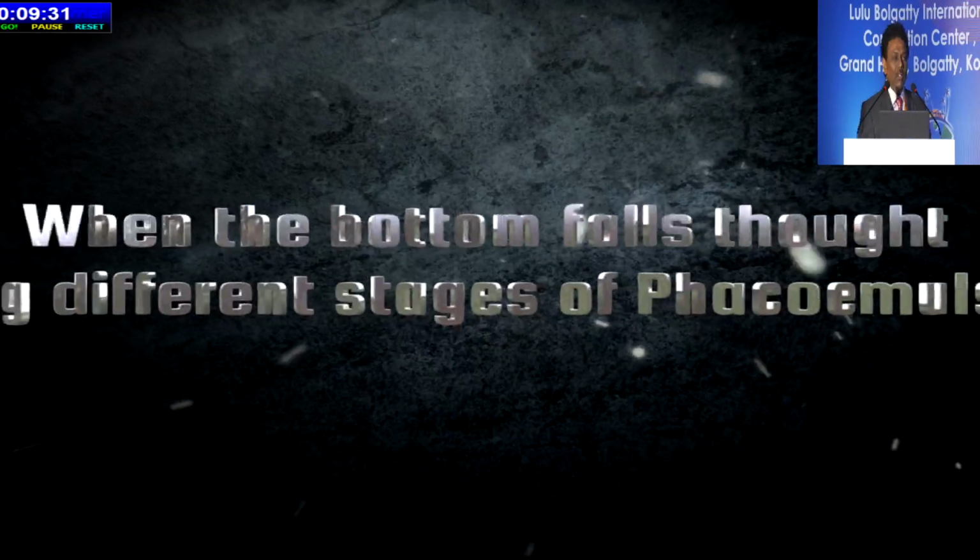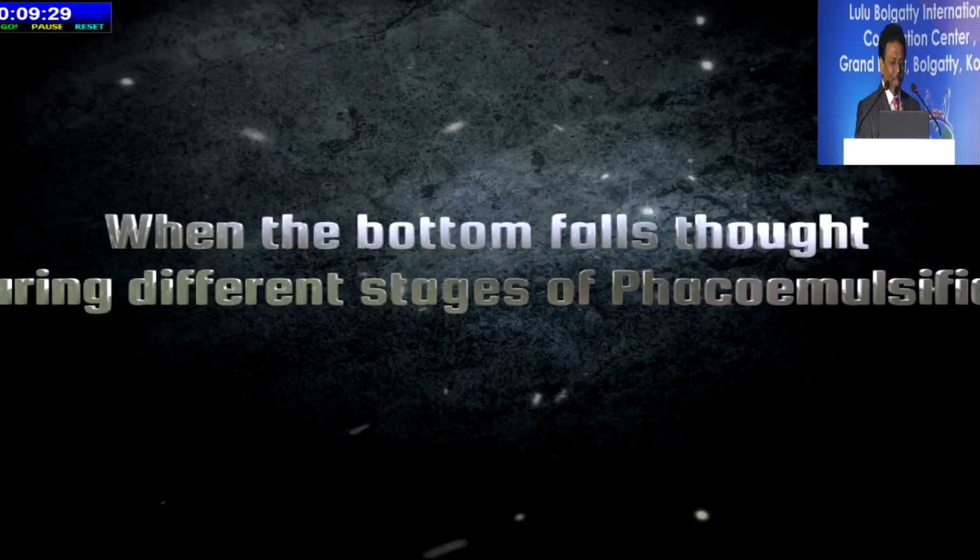Similarly, in surgeries, we are likely to come across many complications, but a wise man is he who salvages the situation even under grave circumstances and provides for the best possible visual clinical outcome. Let's discuss a few case scenarios wherein a posterior capsular rupture occurs.